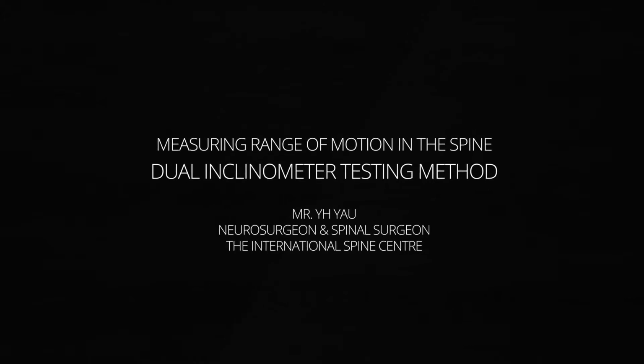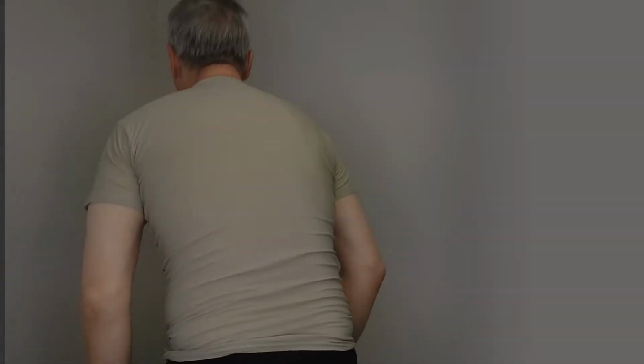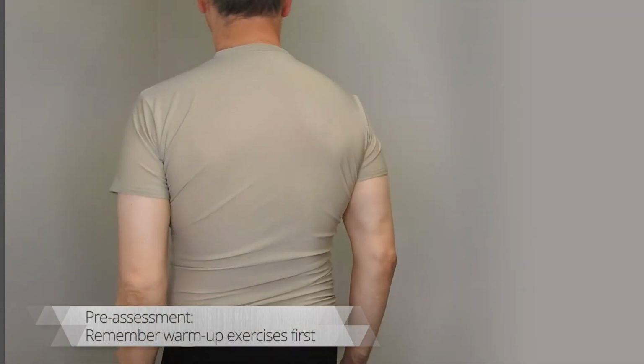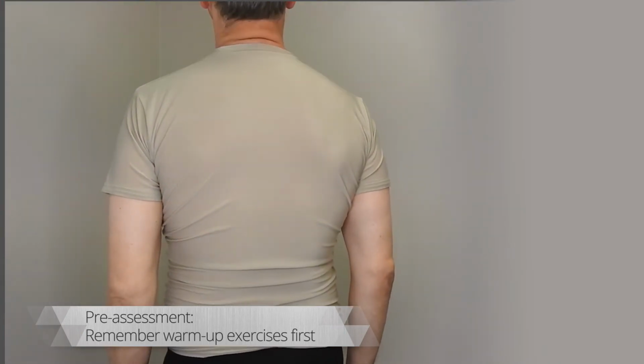Measuring range of motion in the spine, dual inclinometer testing method. Before any measurements, warm-up exercises are undertaken. The subject is asked to move through the ranges of motion.